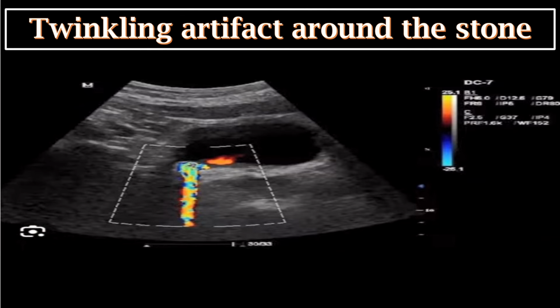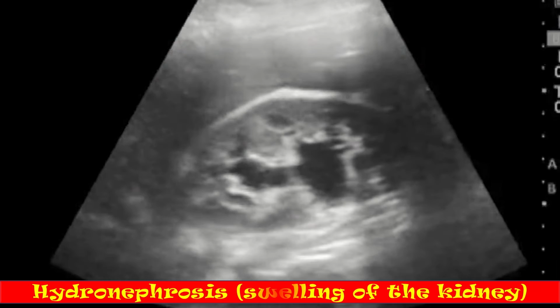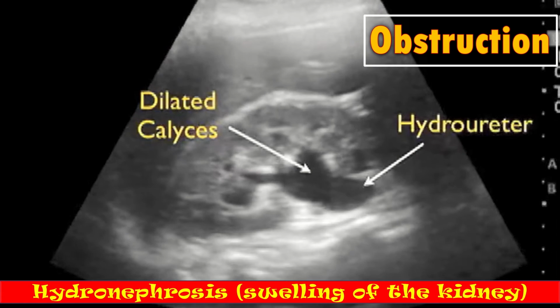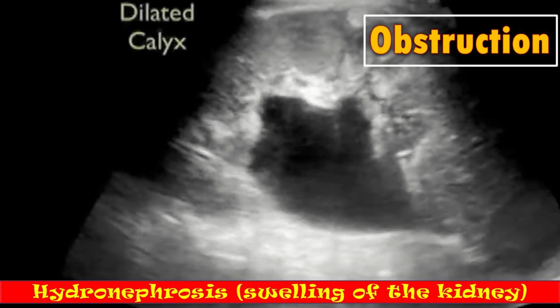Ultrasound can also identify if the stone is causing blockage or obstruction in the urinary tract, leading to hydronephrosis, that is swelling of the kidney, and dilated calyces.